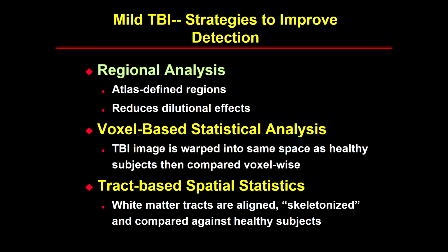That is to say, if we only look at a mean over the entire brain, then it leaves little room for small regional effects. So this is why we break the brain down into effectively 50 different regions. We also do two other techniques that reduce the brain down to even smaller pieces, voxel-based and a tract-based method.